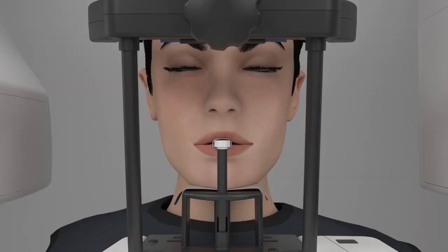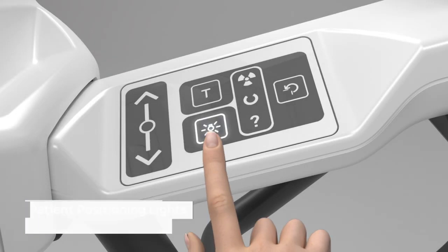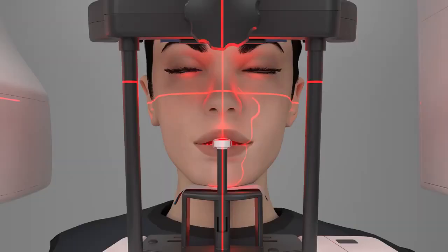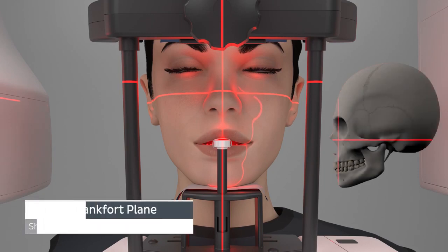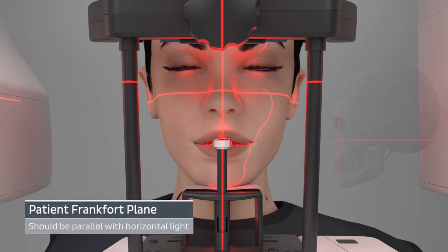Tell the patient to close their eyes so you can use the alignment lights to properly position them. Turn on the patient positioning lights by pressing the positioning light button on the control panel. Adjust the device's height and the patient's head position using the positioning lights as guides. The patient's Frankfurt plane should be close to parallel with the Frankfurt horizontal light.